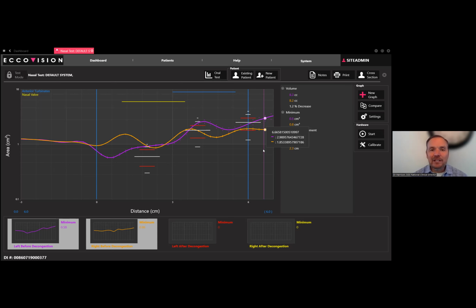And if the average is the big line that you see in the middle of that diamond shape, am I above or below average? The first line in the first diamond shape that I see. So they're towards the upper limit of what statistic norms were considered by Atul Malhotra. So I'm above average at nasal valve.